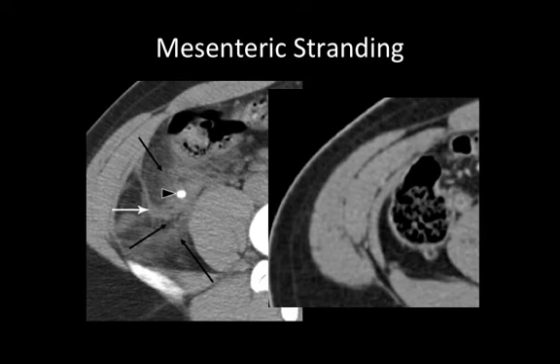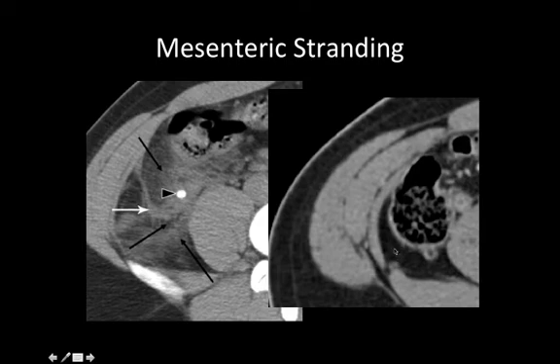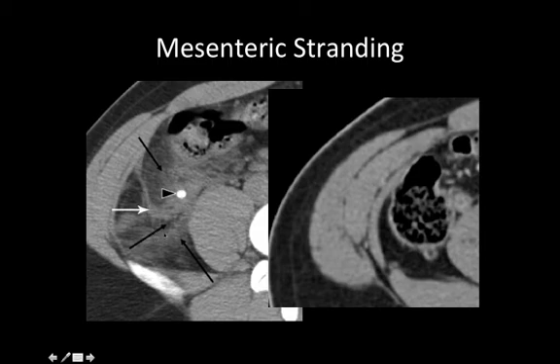This example shows what mesenteric stranding is, or inflammatory changes within the fat. Look at the right image — look at the colon wall and the fat around it. The fat around the colon wall is almost black. Now if you look at the left image, you can hardly define the colon wall, and the fat is gray, hazy, with some lines in it. This is inflammatory change — a result of edema and high blood flow because of inflammation.